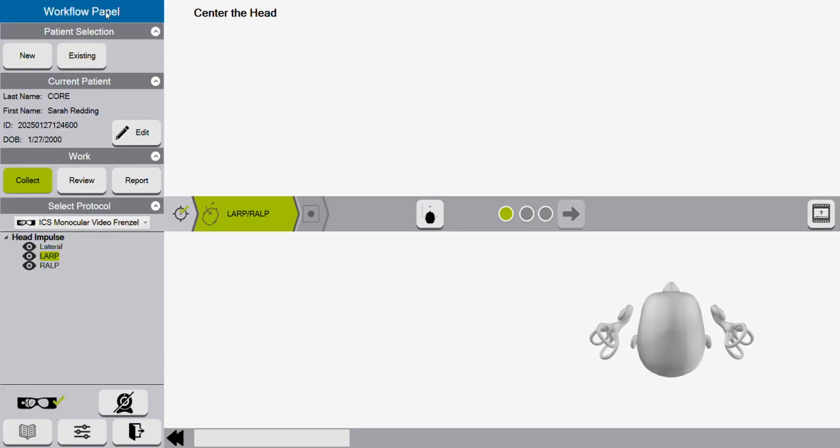Okay, so now that you have finished recording your tracings for lateral V-hit, it will automatically end the recording once you get 20 on both sides, or once you get 20 on the second side. So you may have more on one side, but as soon as you get at least 20 for both sides, it will stop and this screen will appear here.